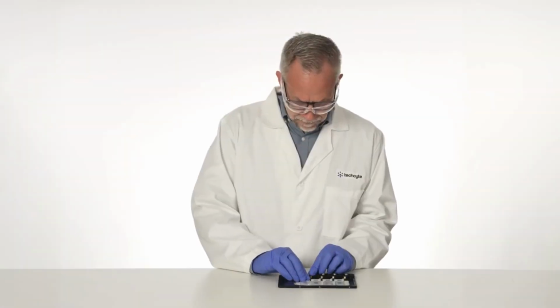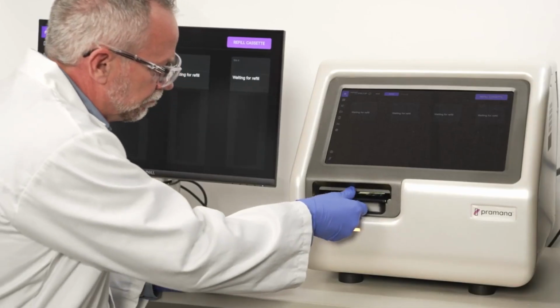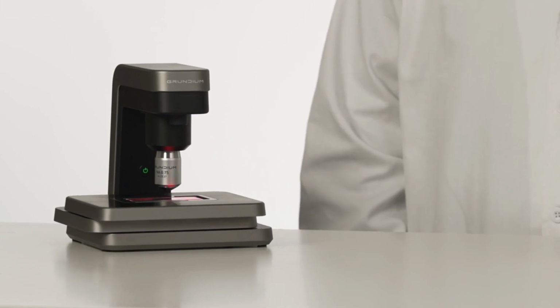Technician loads the cover-slipped slides into a Techcyte validated scanner. The slides are scanned and automatically uploaded to the Techcyte platform for AI analysis.